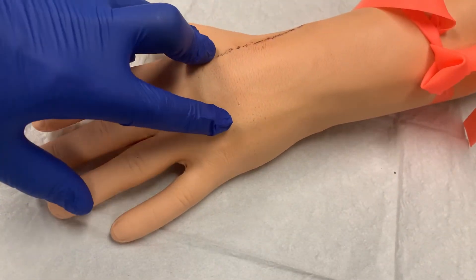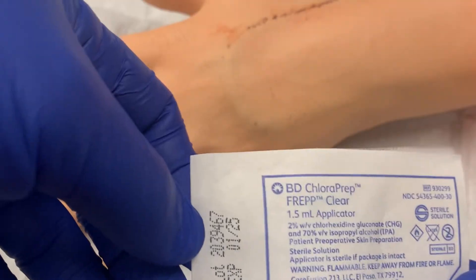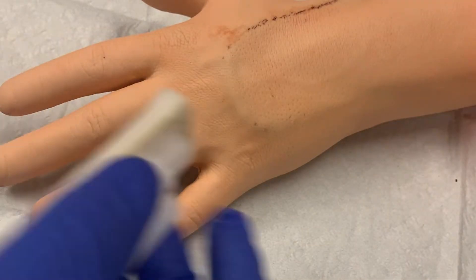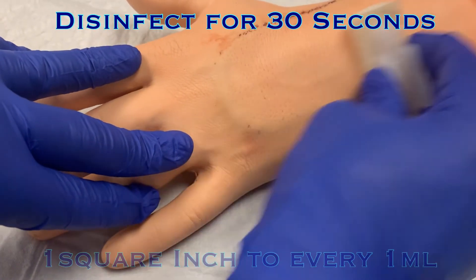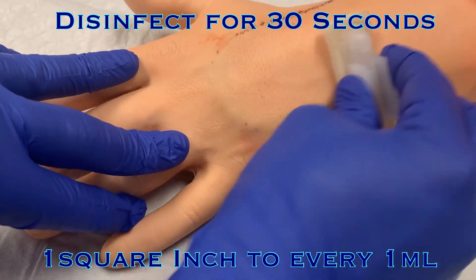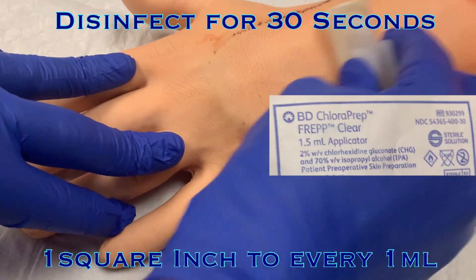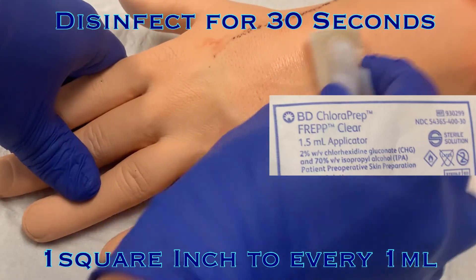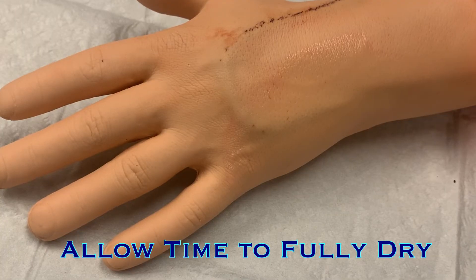When you've located a vein, make note of the location. Then remove the tourniquet and set up your supplies. Clean the site with a chlorhexidine applicator, scrubbing back and forth for at least 30 seconds. Chlorhexidine can disinfect 1 square inch for every milliliter in the applicator. A 1.5 milliliter applicator can only clean 1.5 square inches, so only scrub over the desired access site. Then allow the site to dry completely before poking. Do not blow on or wave your hand over the site to try to dry it more quickly, as this will potentially contaminate the site.